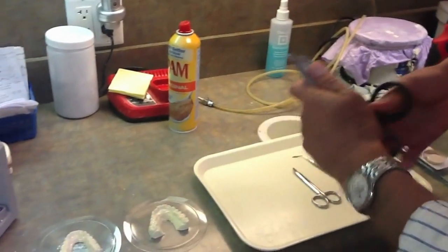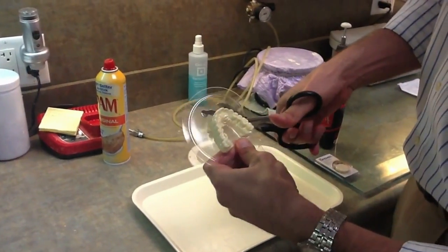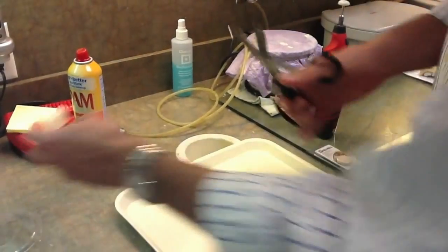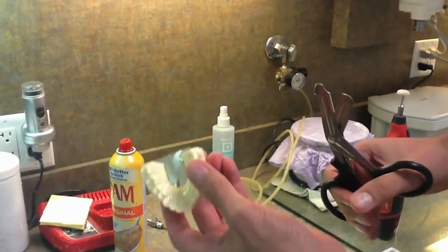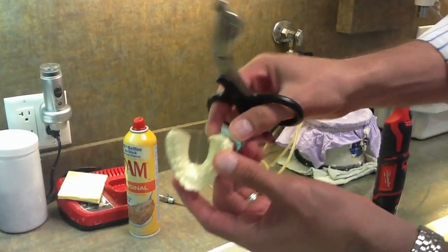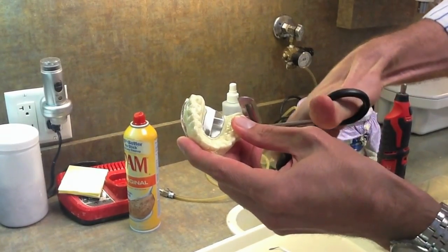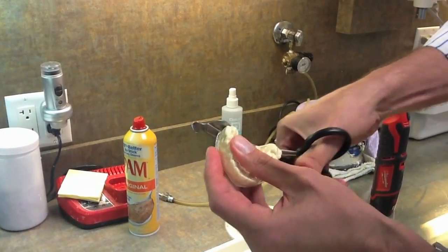The first step is to cut around the periphery with the black handle scissors. Then make one vertical cut right up the center. A lot of times the tray wraps on the back and creates an undercut, making it difficult to remove. Just take the scissors and cut — don't worry about cutting into the model, as what we're removing is not an important part of the appliance, so we can go ahead and cut that portion of the tray off.